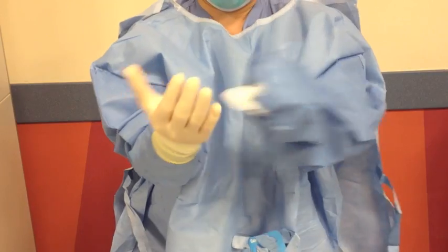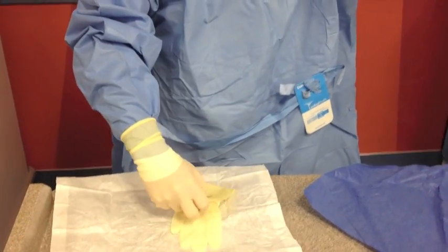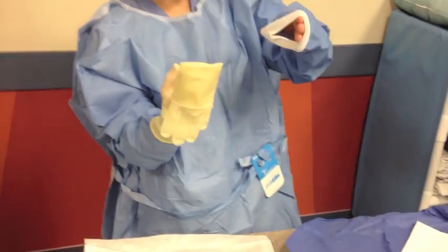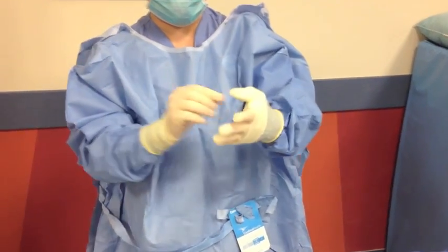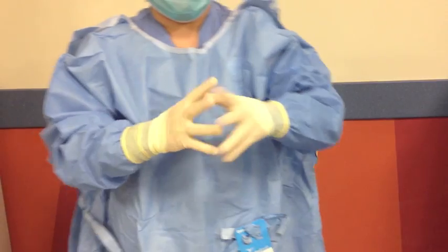Once you have your fingers out, you can adjust it and get your fingers into the glove. Next, grasp the left-sided glove, open up the cuff, place your hand through and then fold it over. You have more freedom on this side because you already have a sterilely placed glove on the right hand.